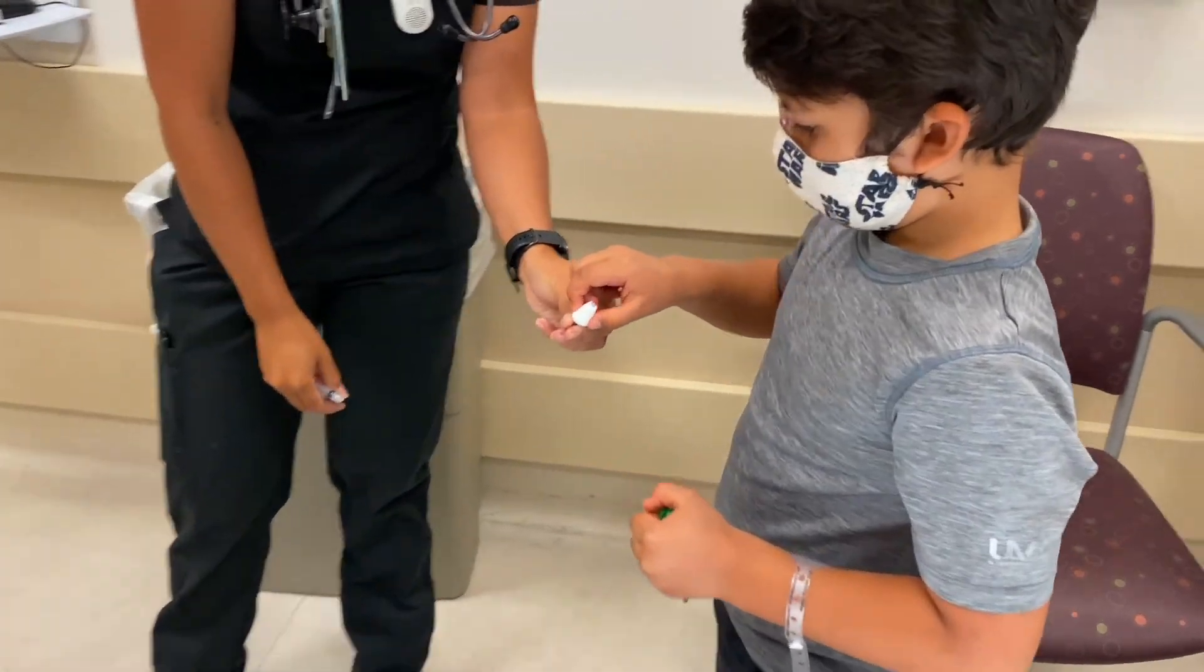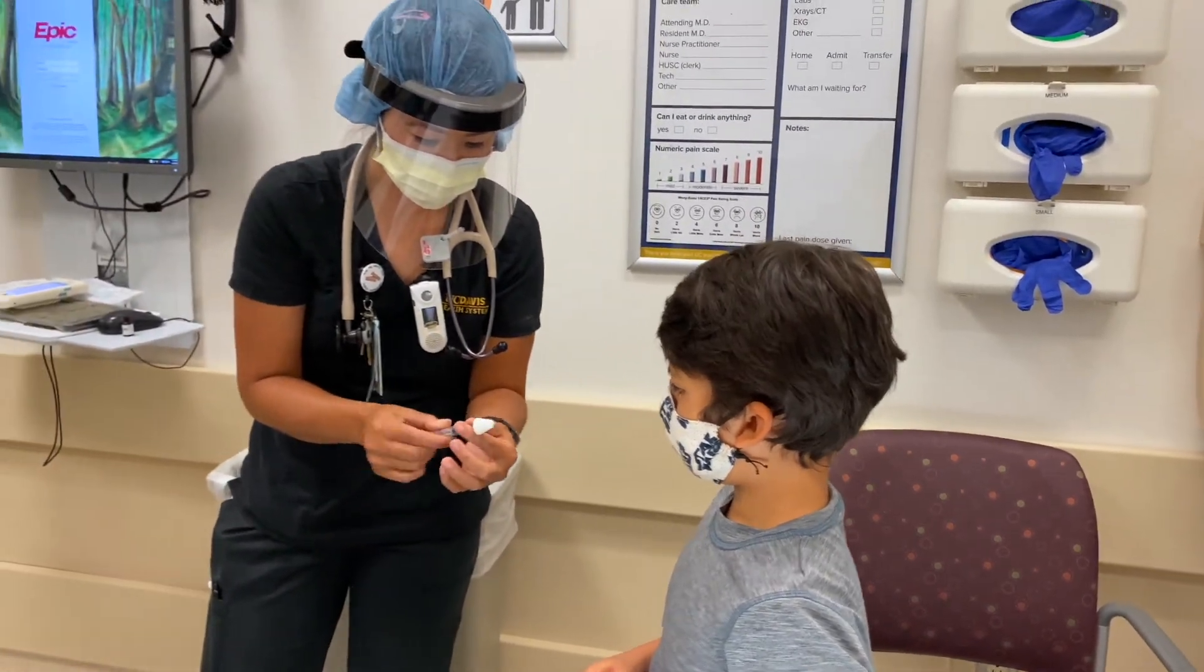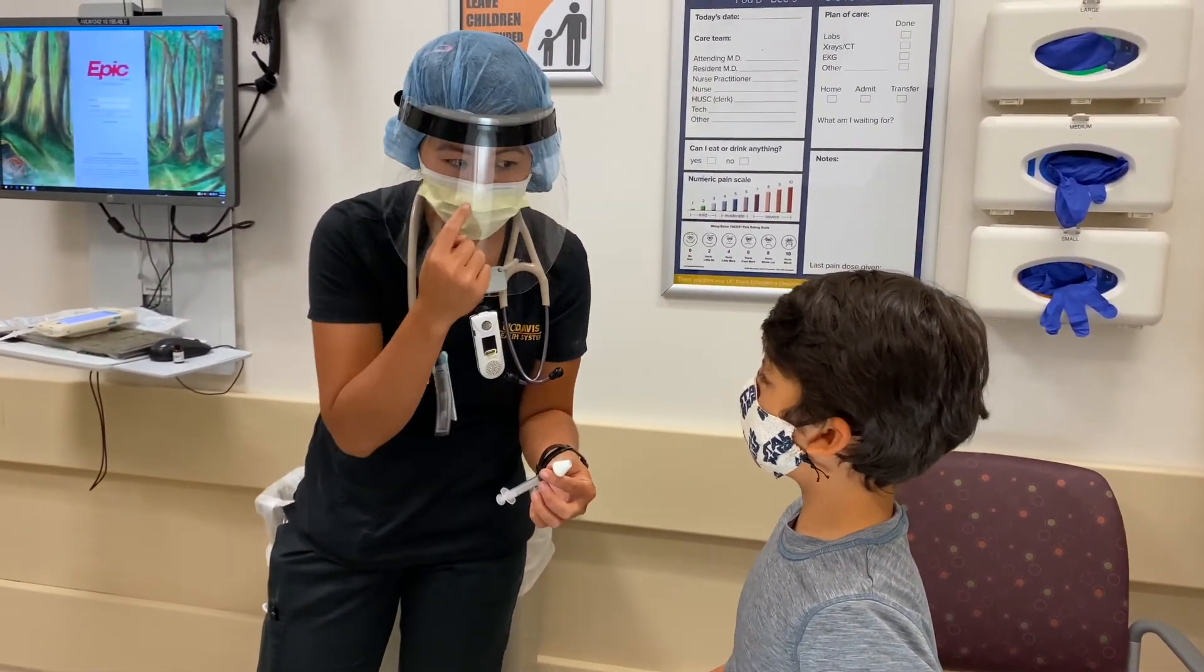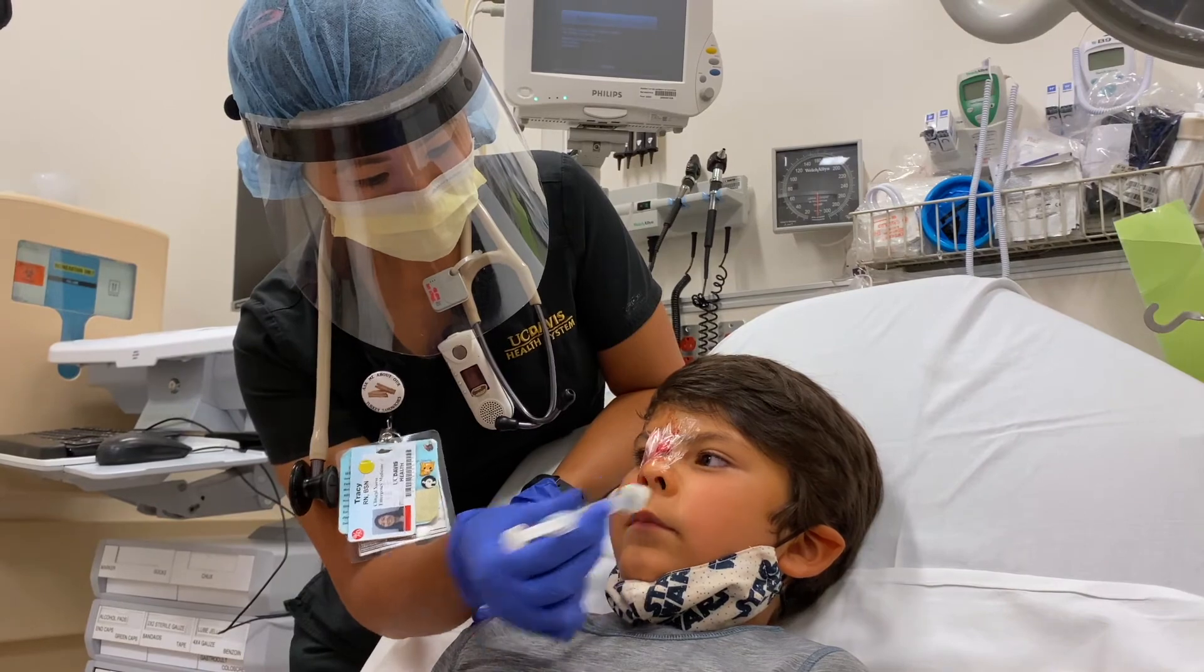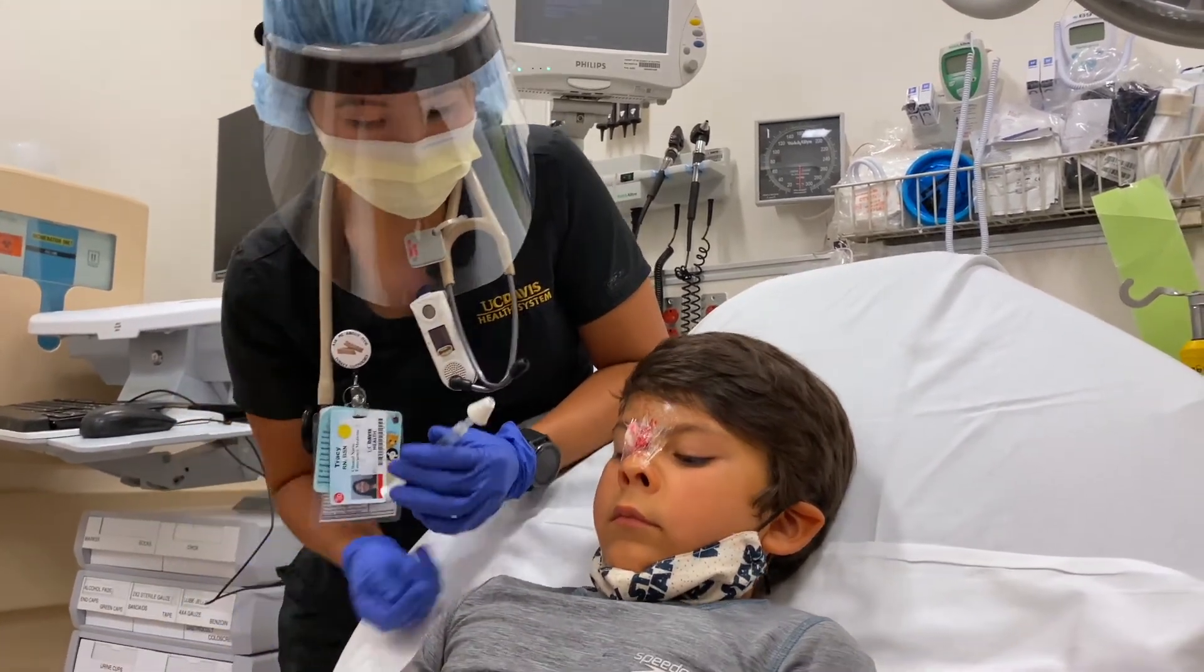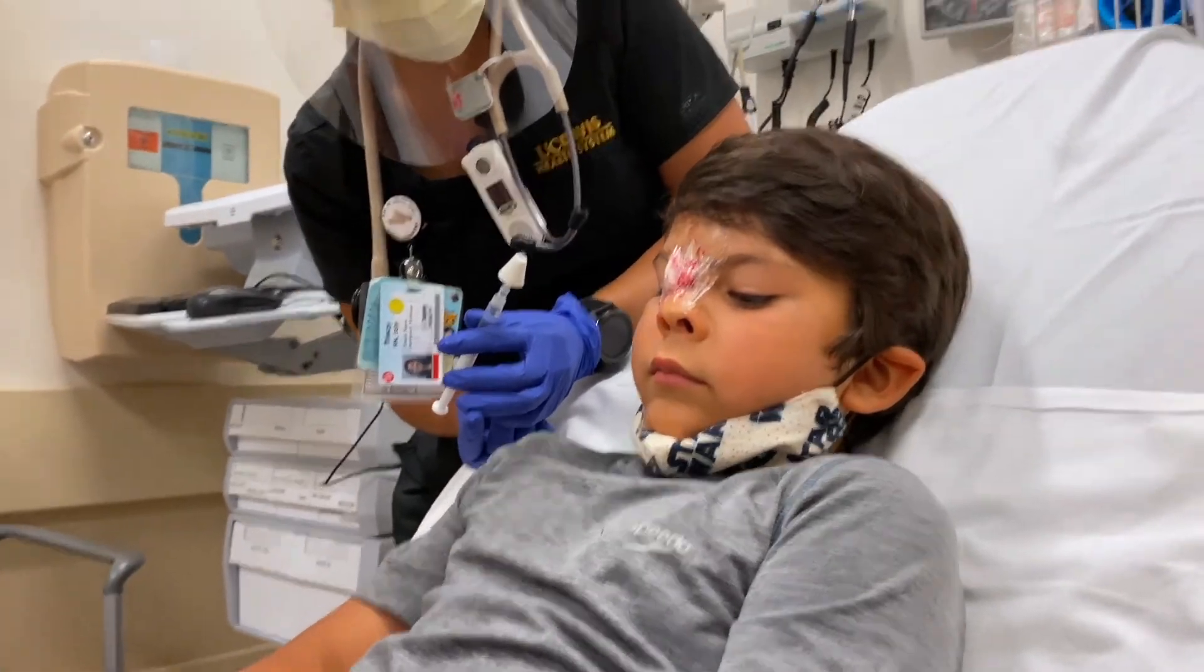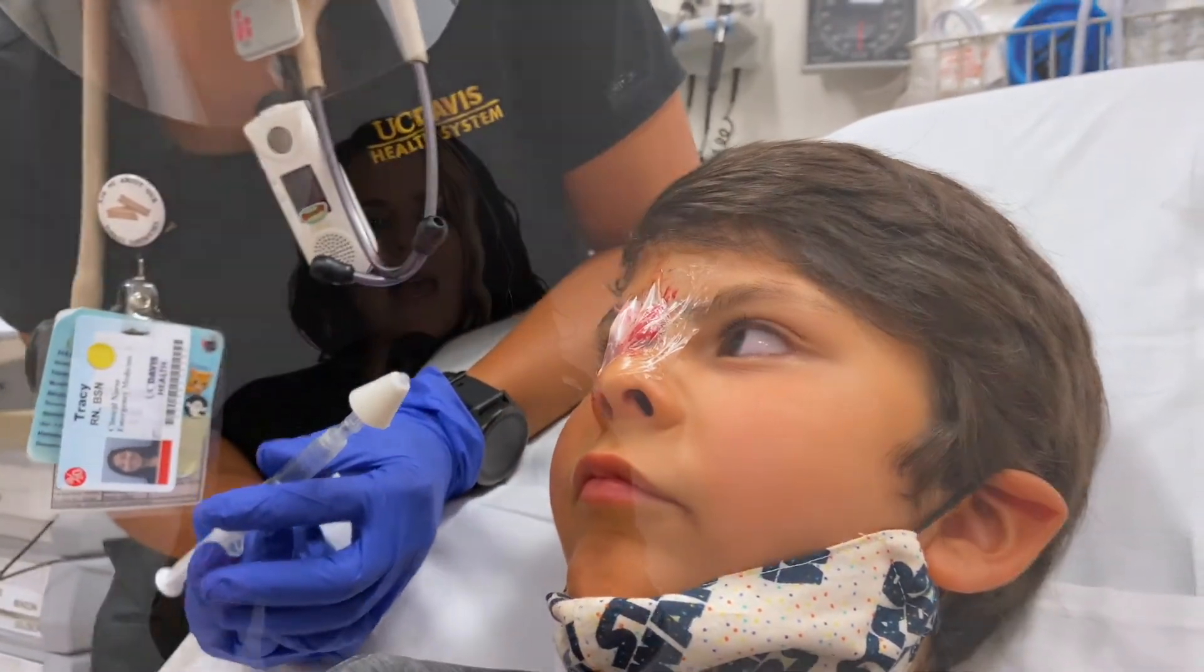Now, here you can see Tracy is letting Jordan touch and feel the mucosal atomizer device. She's letting him know that this is going to feel a little bit uncomfortable. She describes it as the sensation you have when you jump into a pool and you get water up inside of your nose. Uncomfortable, but doable. Let the child ask questions and let them anticipate what's going to happen.